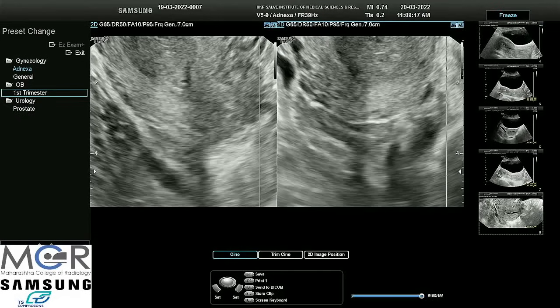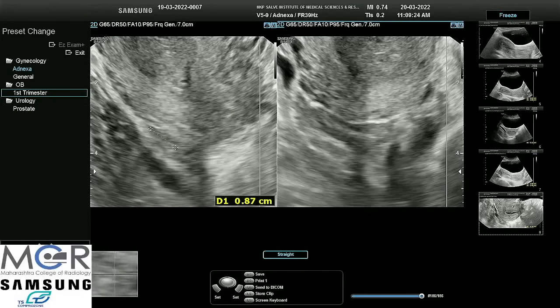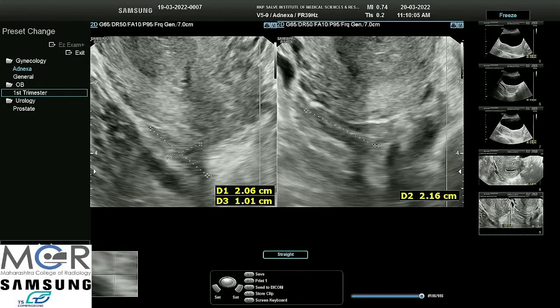Measurements are taken in both axes for the ovary. The longest axis is considered. We have these three values — the right angles to either of the images at the maximum point. The machine settings should be such that taking these three values, we get the volume.